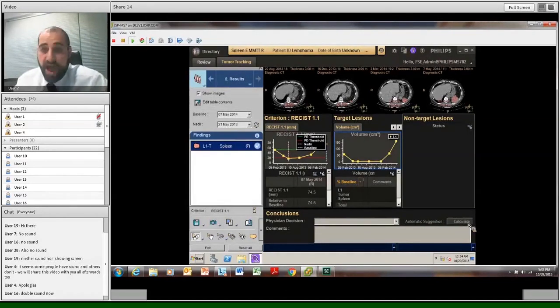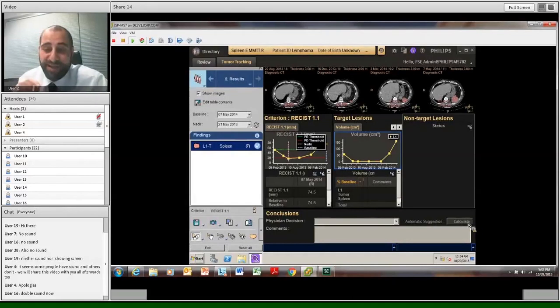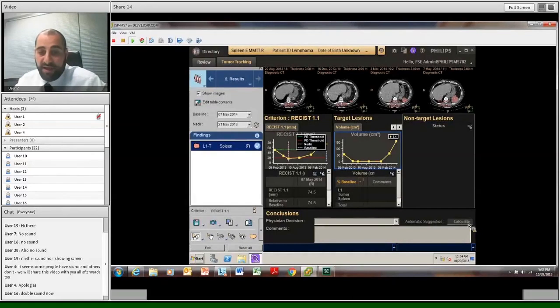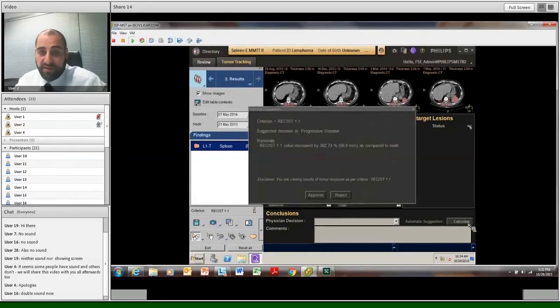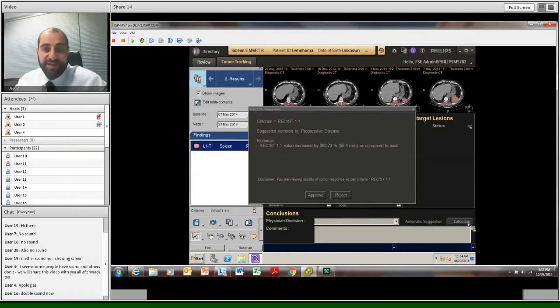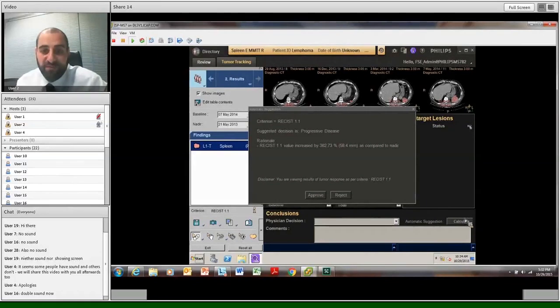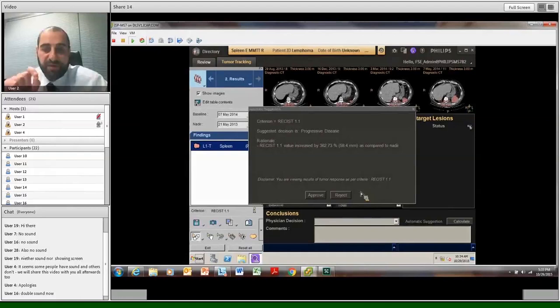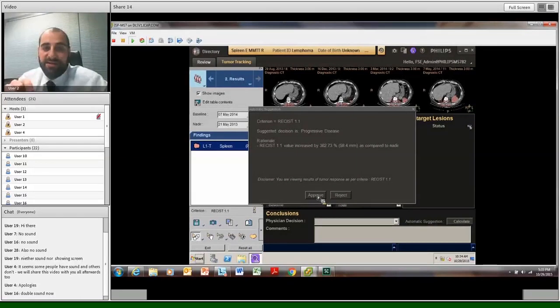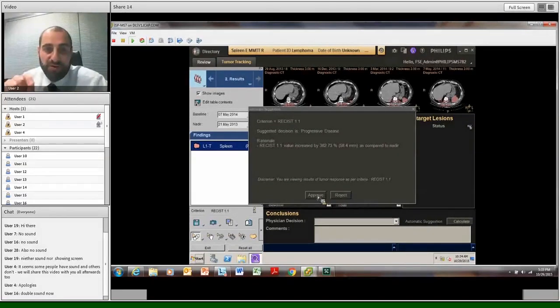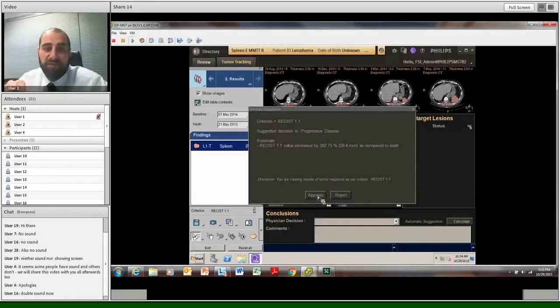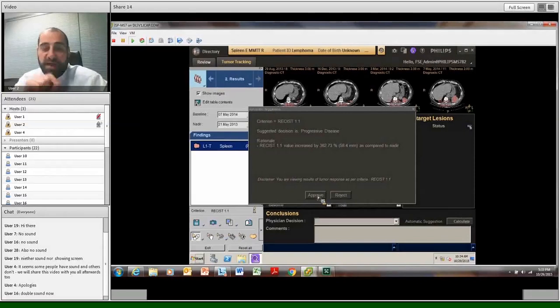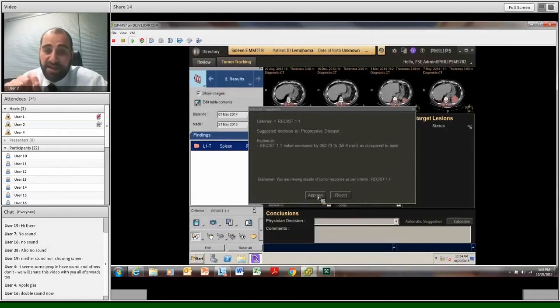When we look at the target lesion, we're not looking just at long axis changes. We can look at short axis changes, and we can actually look at the volume of the lesion changes over time. This is now automated. I don't need to go in there and do bidimensional measurements and try and calculate volumes based on slice thickness. It was three clicks of a button. It was instantaneous. It has now saved time.